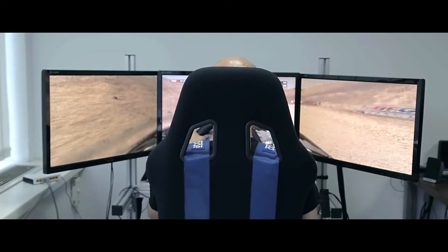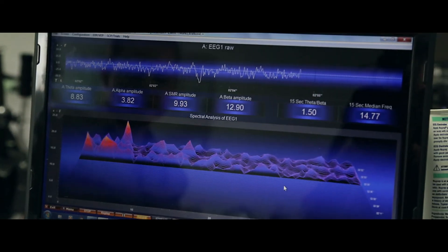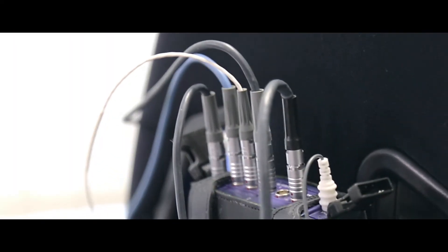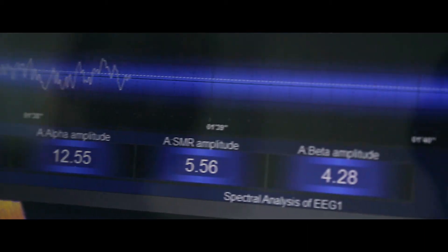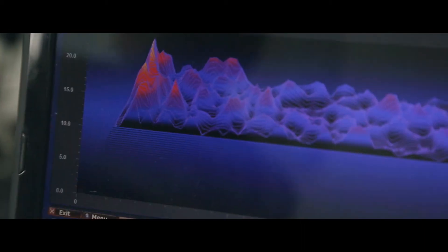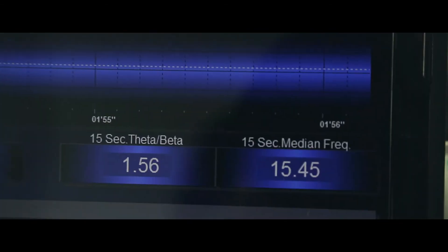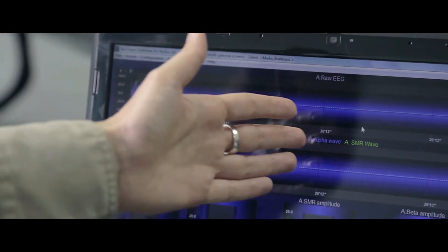There are some groups we have already detected, but we would like to see combinations of psychophysiological responses to determine this hypothesis. We also have a computer attached to our biofeedback device called the Nexus Mark 2. Here we have an EEG screen measuring different brain waves during driving, determining which frequency is dominant during certain scenarios and critical moments.